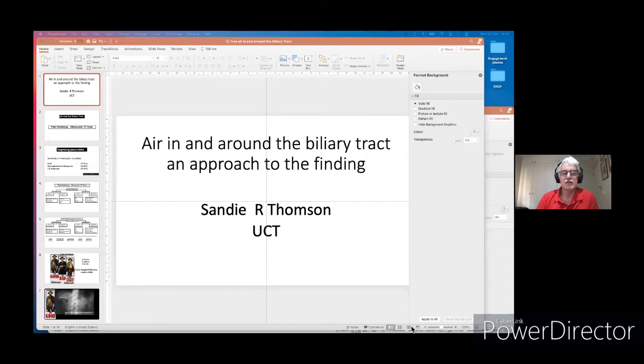Now, of course, it's relatively easy to distinguish. And then CT scan. What Jeremy was saying is that, surprisingly, in about 40% of cases, the abdominal X-ray will be abnormal when it's present. It's a question of whether you look in the right place, and it may indeed be very, very subtle.